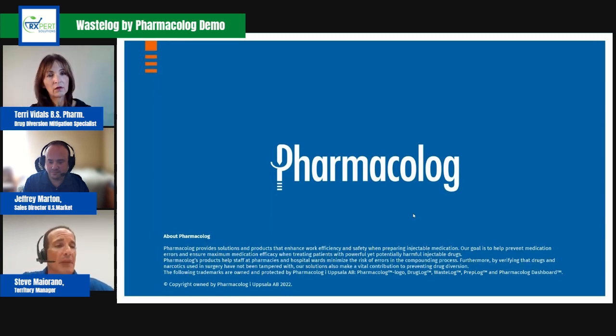No, you wouldn't have to put them in. So what we do is, once we have the information from whichever system the hospital is using, those specific parts of the barcode are the ones that we pick out and put into the fields that we need. Okay. Yeah, because I've seen it with PCA syringes: every new batch that came into the pharmacy, the barcode was different, and it just became very laborious to put in there. I mean, not your system, but just to read it on the scanner for the automated dispensing machine.